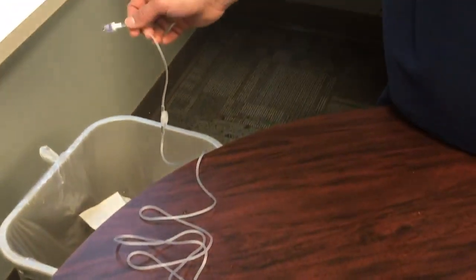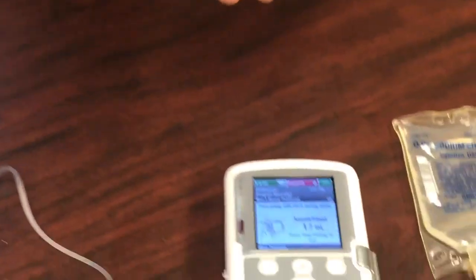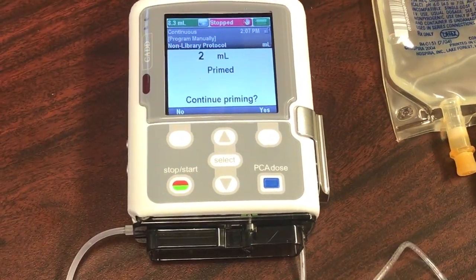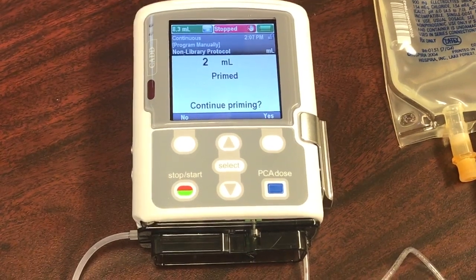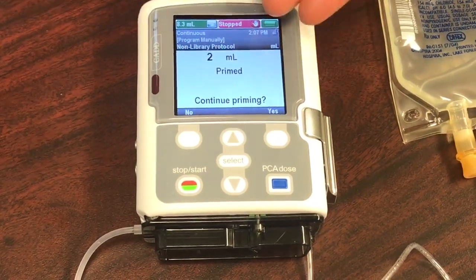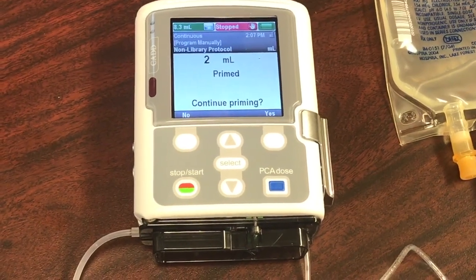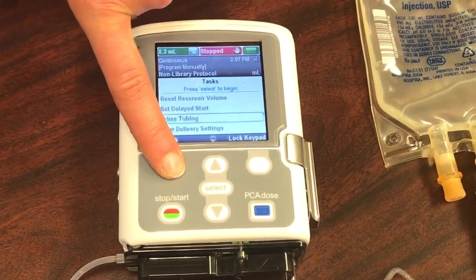Once you see that medication is dripping at the end of your tubing, go ahead and stop priming by hitting the Stop Priming button. It will give you a message asking if you want to continue priming. If you do not see medication dripping at the end of your tubing, go ahead and continue priming. But if you see medication dripping at the end of your tubing, stop priming by pressing No.